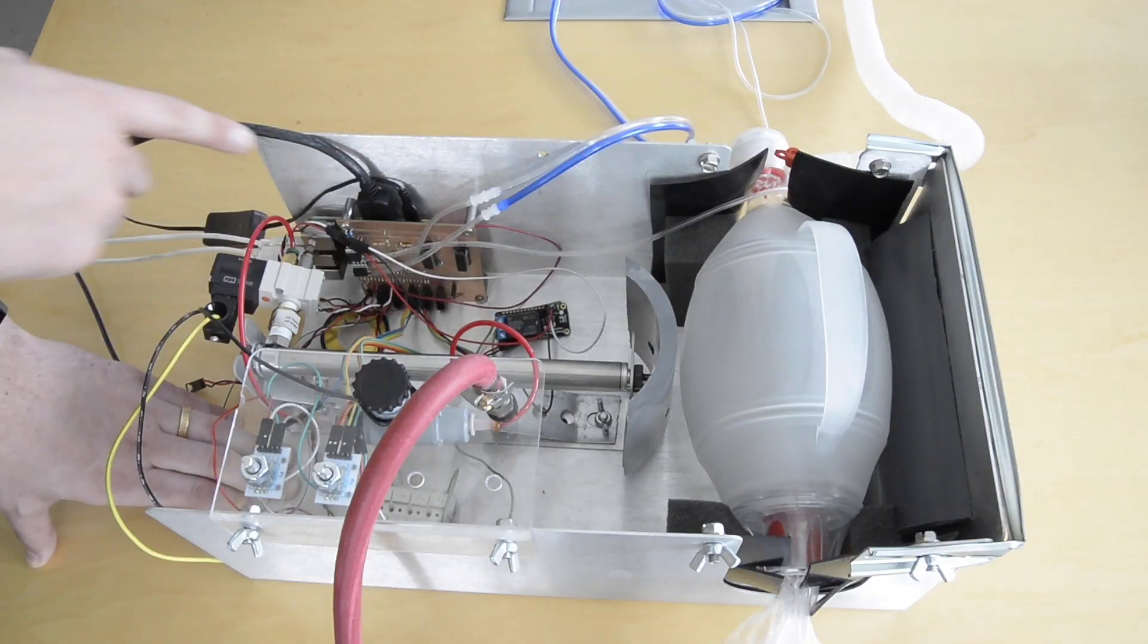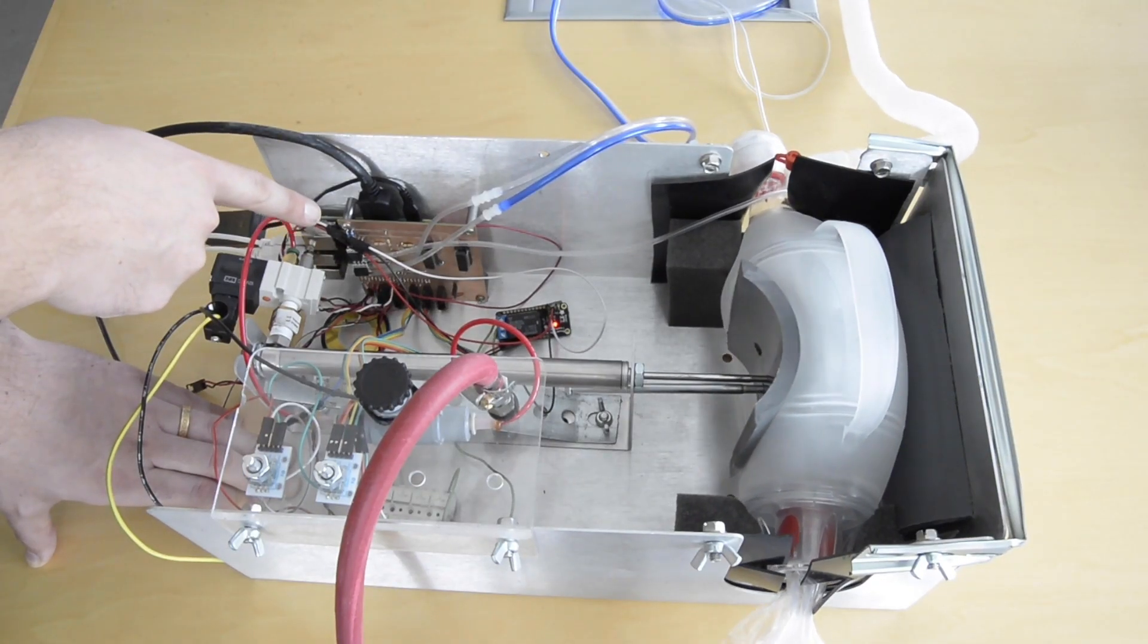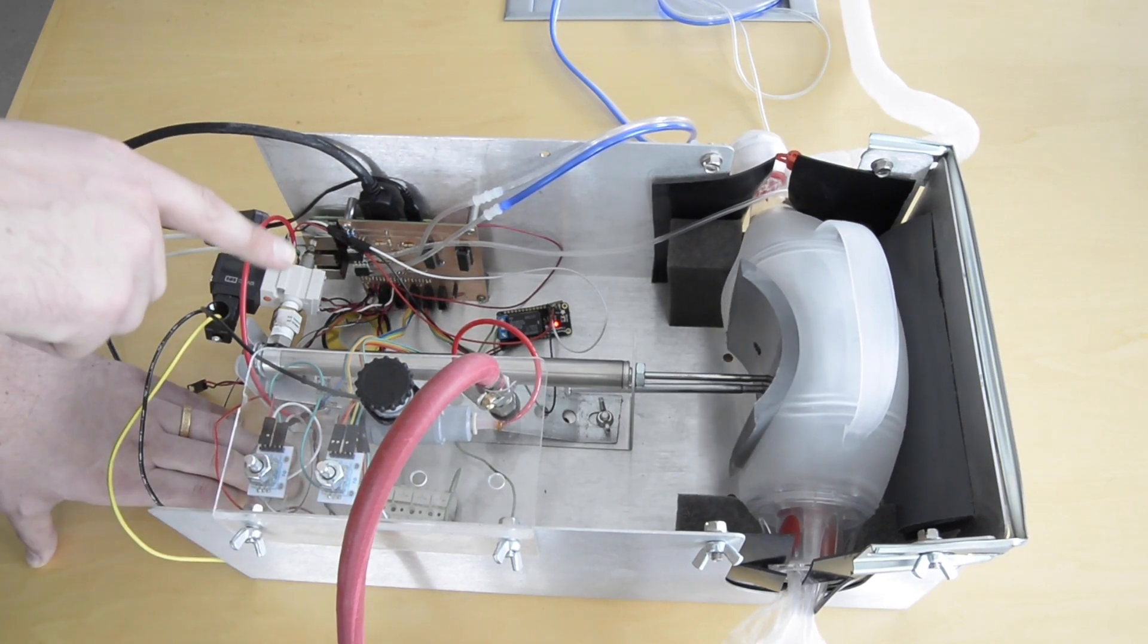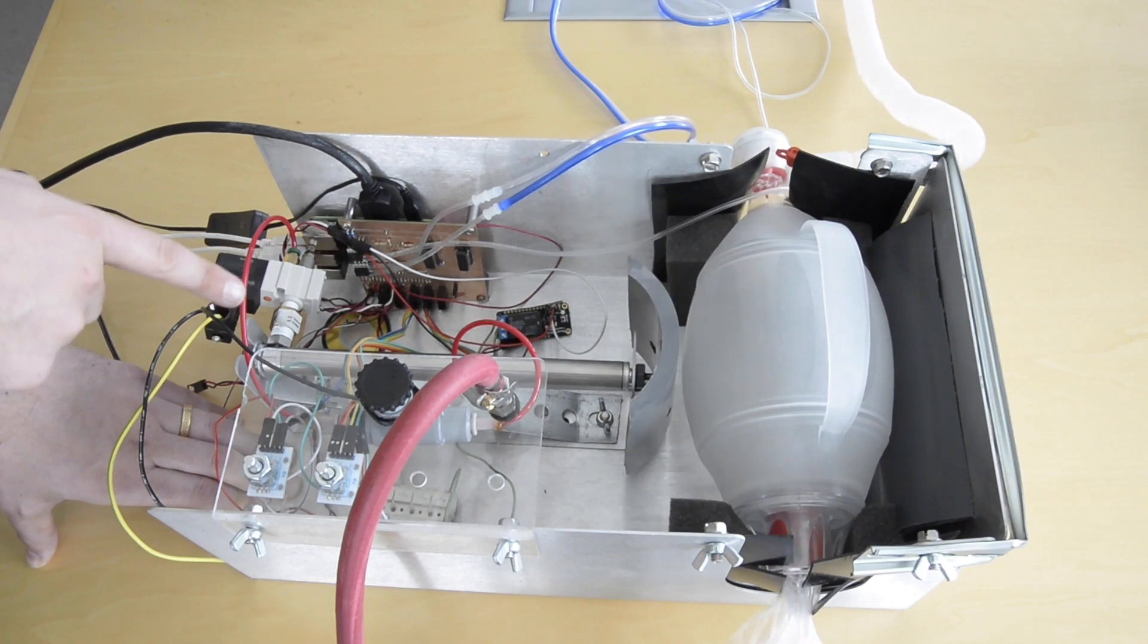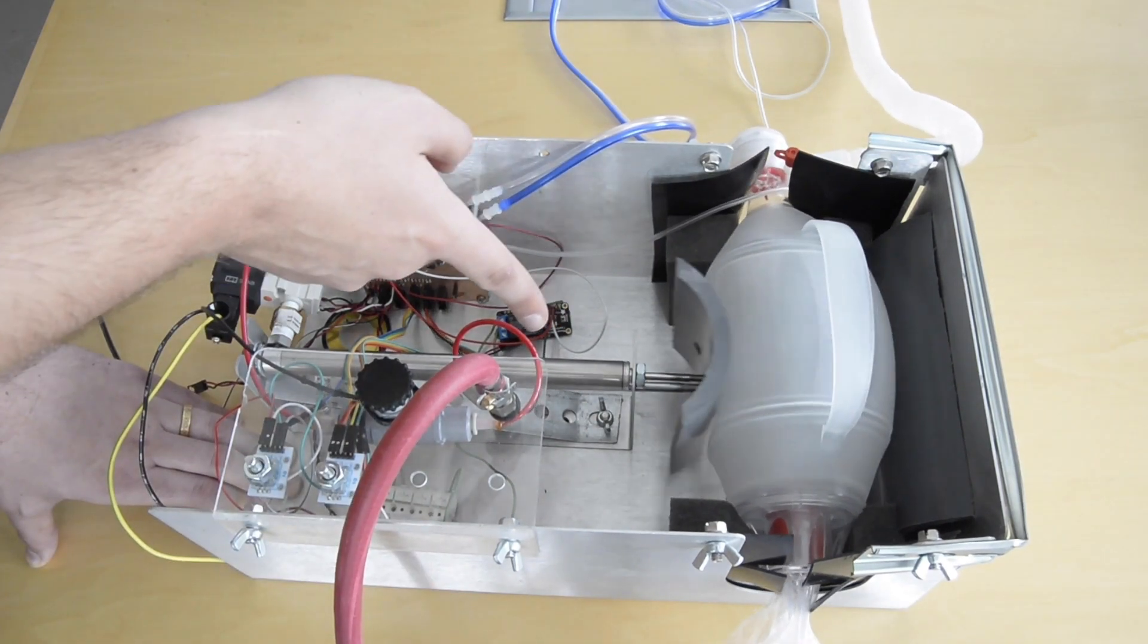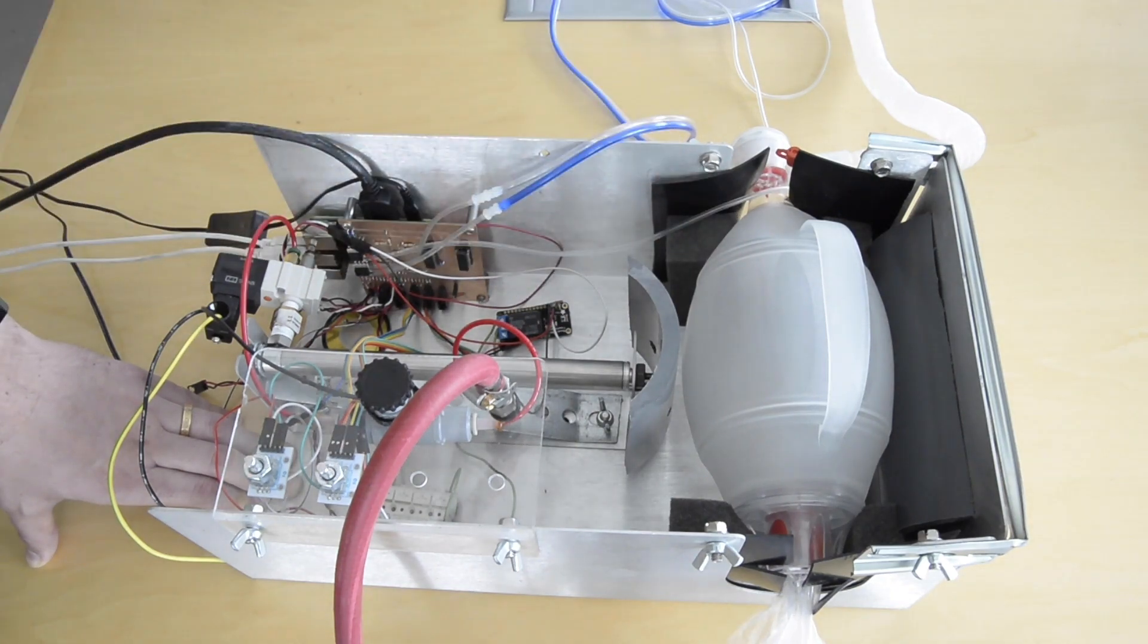The ventilator is controlled by a Raspberry Pi and custom breadboard. Inputs can be put in using encoders, and the ventilator is powered by using a compressed air line which goes into a piston which then compresses an ambu bag.